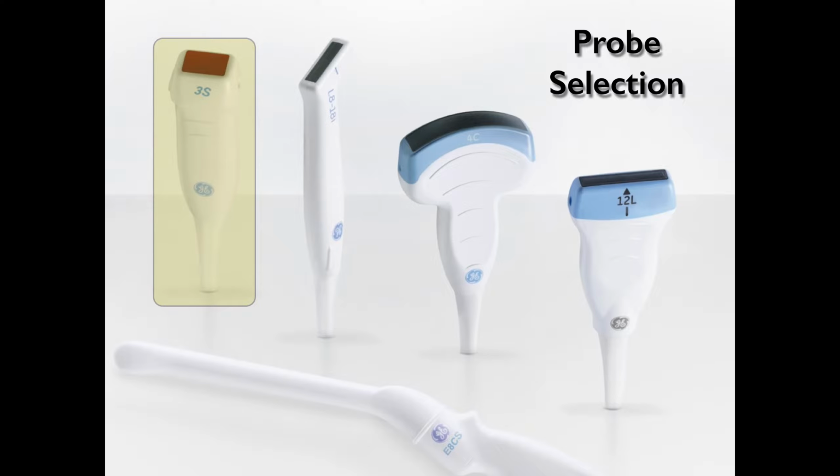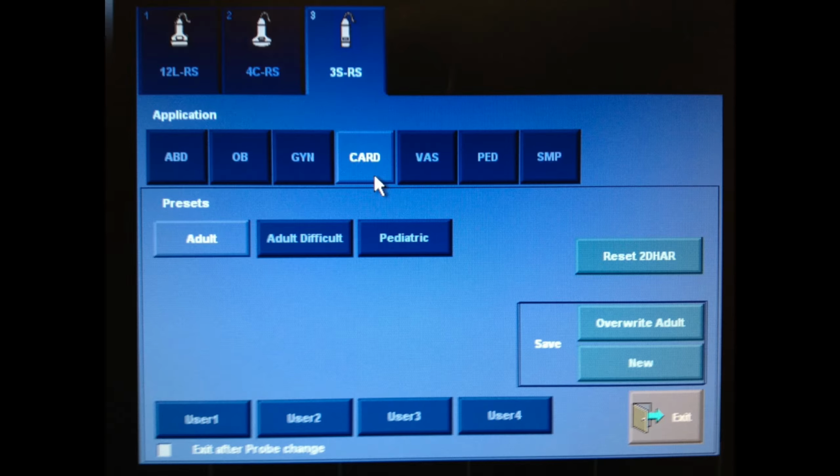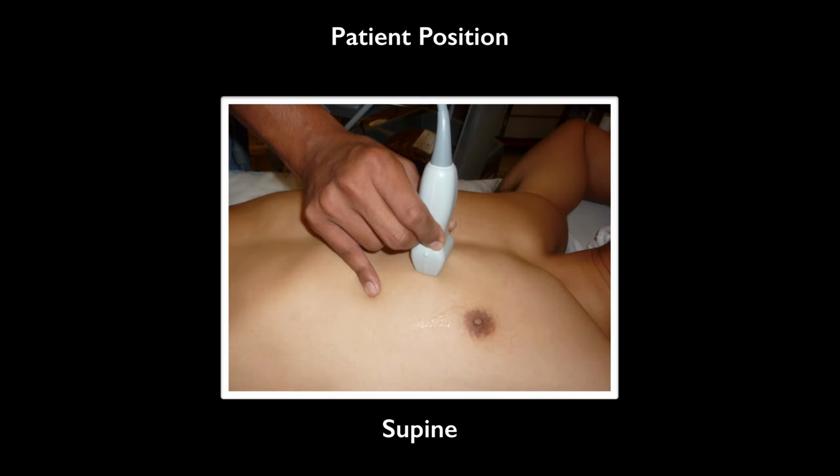Regarding probe selection, you want to use a phased array probe. The reason for that is, as you can see, it has a small footprint compared to, let's say, a curvilinear probe. And it also has low frequency, which allows it to have good penetration and depth. Every machine is going to be a little bit different, but you want to make sure you change the preset on your machine to cardiac mode. Sometimes they also have a difficult setting, which allows for patients with more difficult penetration.